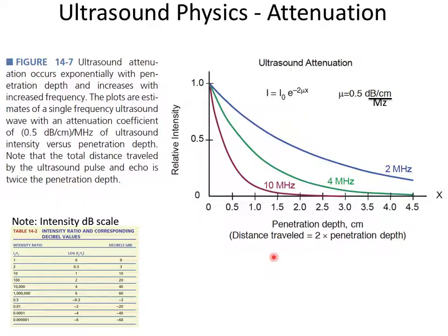But the point I'm making is that the ultrasound wave itself is depositing energy in the patient as heat, right? And so most of the energy goes as heat. And therefore, as you look at the intensity of the ultrasound wave as you move deeper and deeper into the patient, it drops away. The simplest model is this exponential curve as a function of depth. So here's the surface, and assuming we're in the same medium, right?